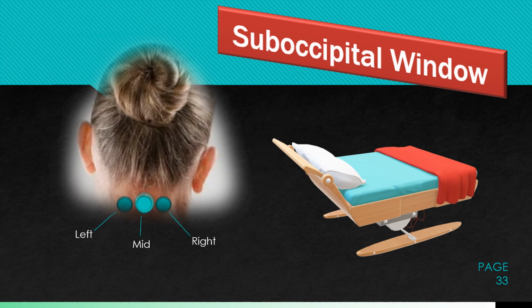It will just depend on each position, and these windows you can see here on the left image show your left, middle, and right suboccipital windows. Most frequently, you will use your lateral windows versus your mid window on your adult patients.